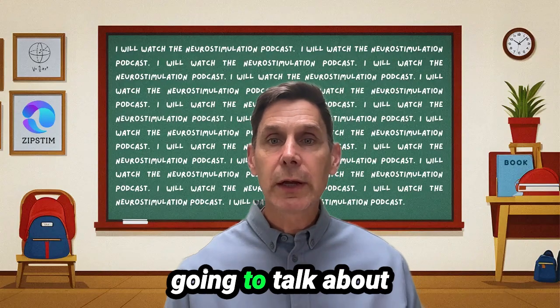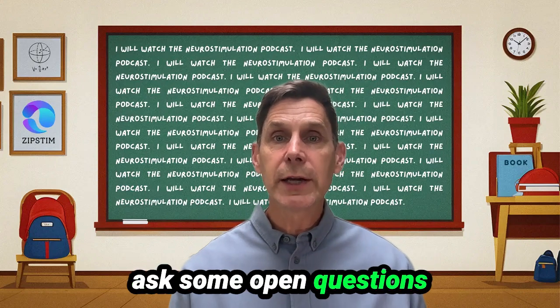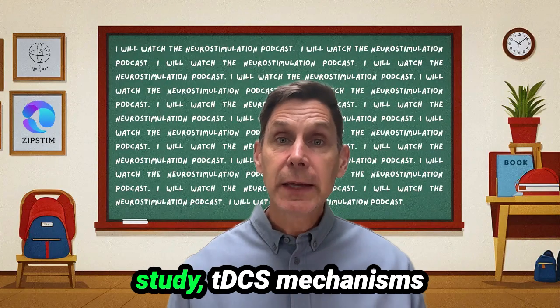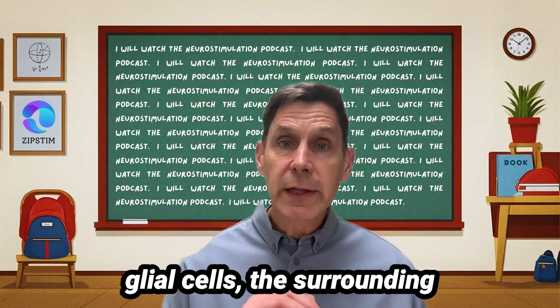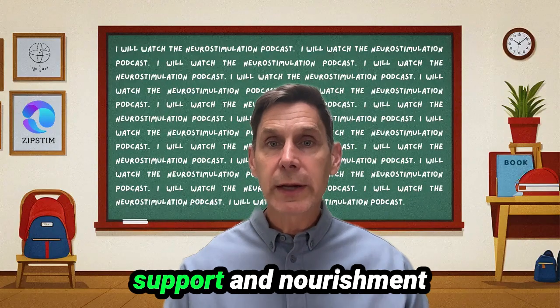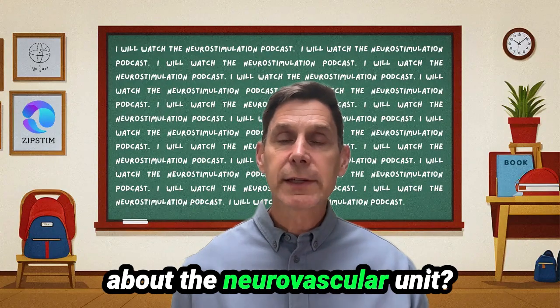In segment 8, we're going to talk about mechanistic nuances and ask some open questions for future consideration. Despite decades of study, tDCS mechanisms are still being refined. Some open questions include, what's the role of glial cells, the surrounding structure that provides support and nourishment for the neurons? And what about the neurovascular unit?